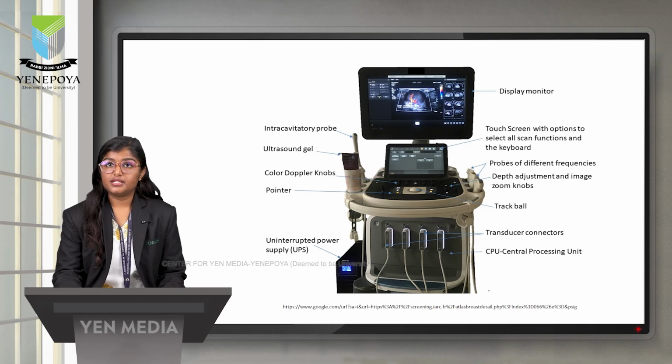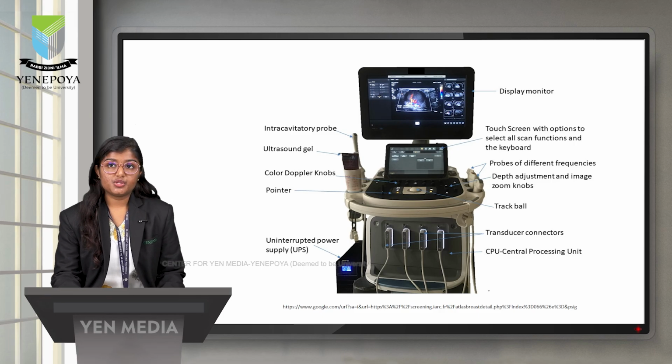Starting with a display monitor, then the touch screen with option to select all scan functions and the keyboard, probes of different frequencies, depth adjustment and image zoom knobs, trackball, transducer connectors, central processing unit, intracavitary probe, ultrasound gel, color Doppler knobs, pointer and uninterrupted power supply.